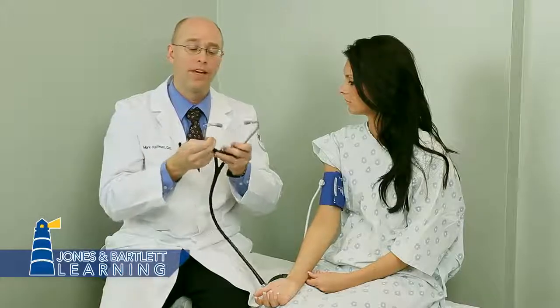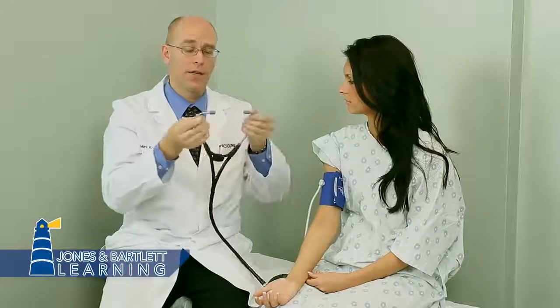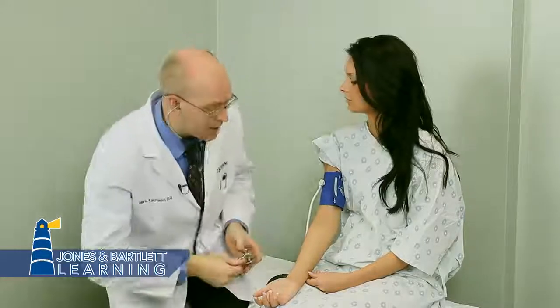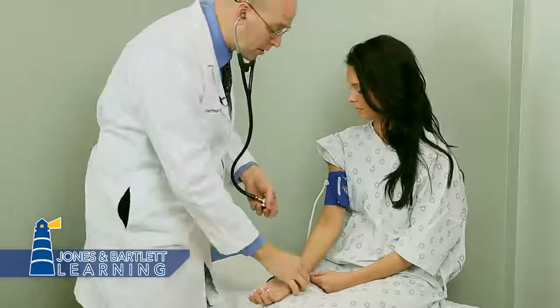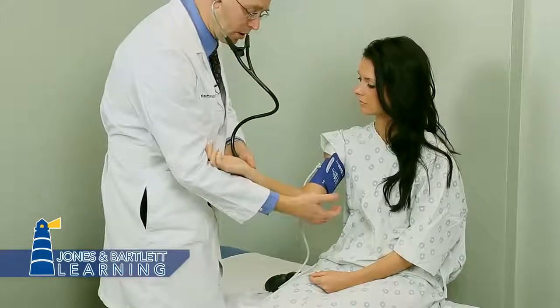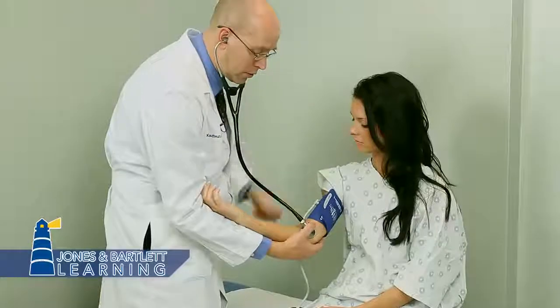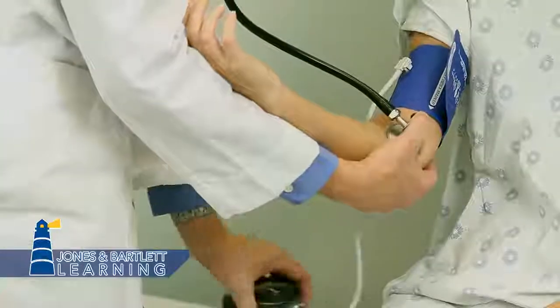Stethoscope. Remember, the ear canals go anteriorly, so that's how you'd put your stethoscope into your ears. And this technique is called the cross-arm technique, where I pick up the patient's arm, rest it on my forearm, place my stethoscope head over the medial part of her antecubital space.